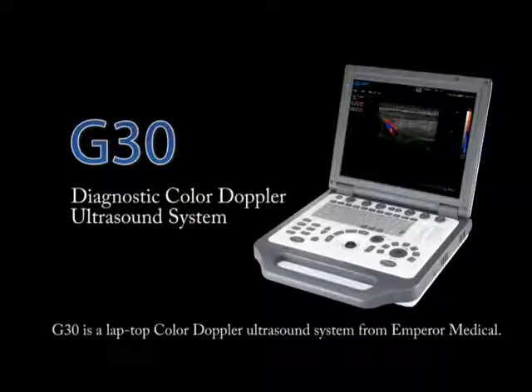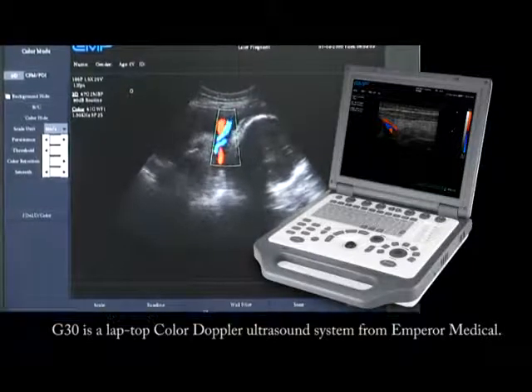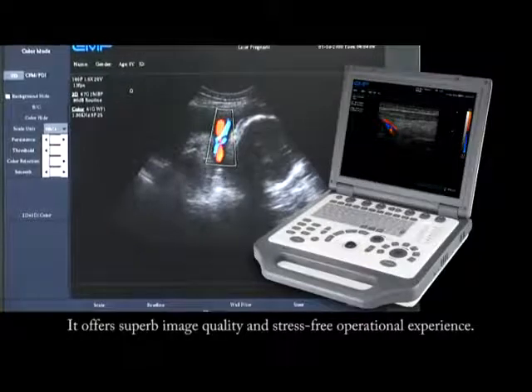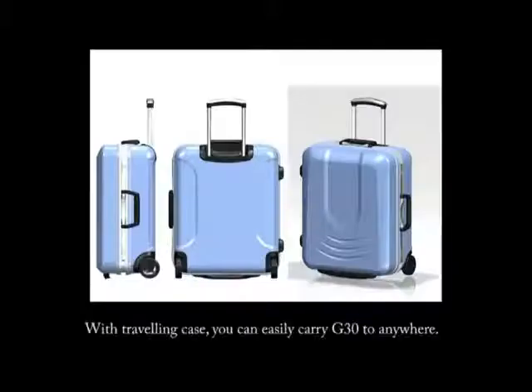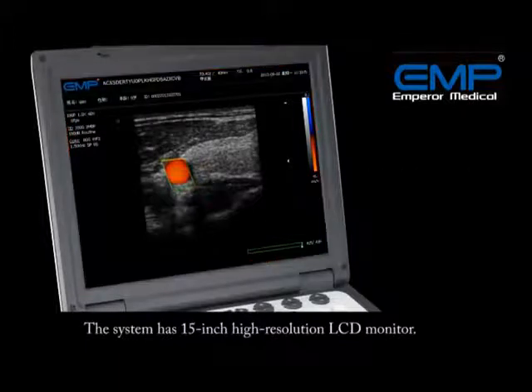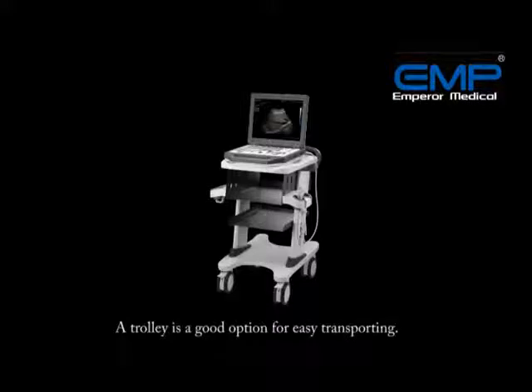The G30 is a laptop Color Doppler ultrasound system from Emperor Medical. It offers superb image quality and a stress-free operational experience. With a traveling case, you can easily carry the G30 anywhere. The system has a 15-inch high-resolution LCD monitor, and a trolley is a good option for easy transporting.